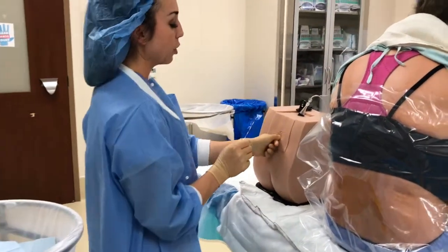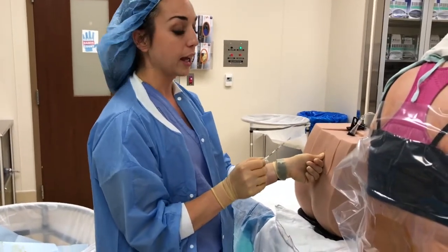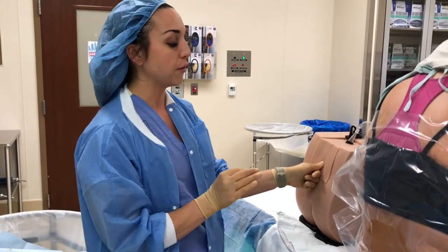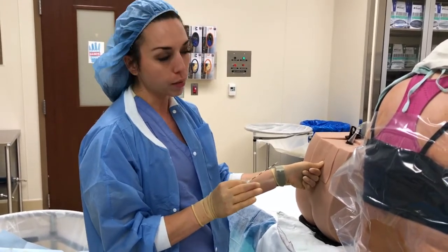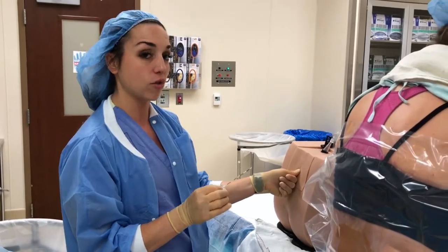So again, once she is properly numb, at this point I'll tell mom, okay, I'm going to insert the next needle. You should just feel pressure in the middle of your back. If it feels like more than pressure, if you feel a sharp pain or a stinging or a burning sensation, let me know, and let me know if it's left-sided or right-sided.